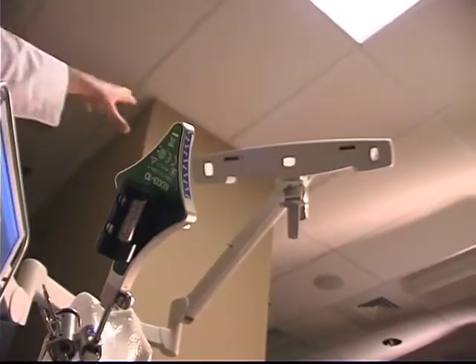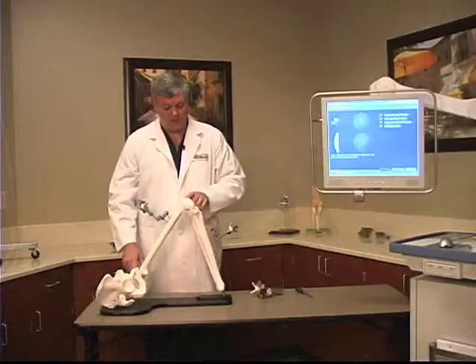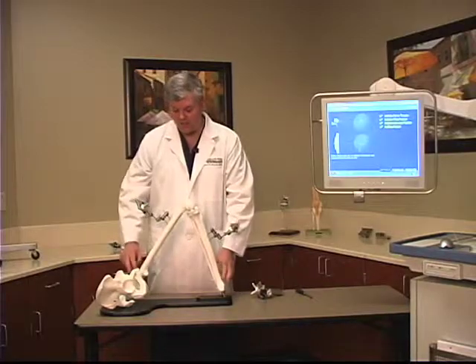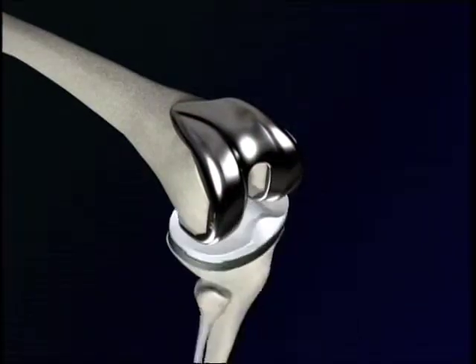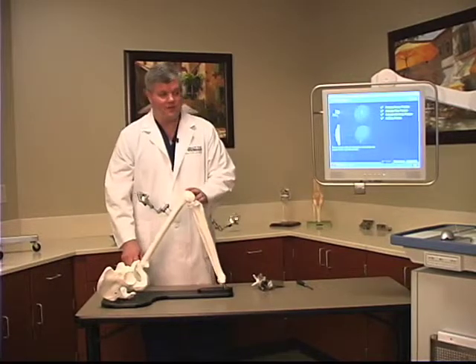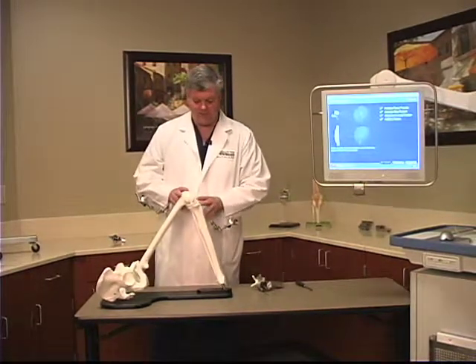It's defining where this knee is in the alignment of the hip, knee, and the ankle, which make up the anatomic axis. The mechanical axis are just the hip and the ankle alignment. We're going to place a knee or resurface the ends of this knee based on the mechanical alignment. First of all, we need to define how the computer makes up the mechanical alignment.